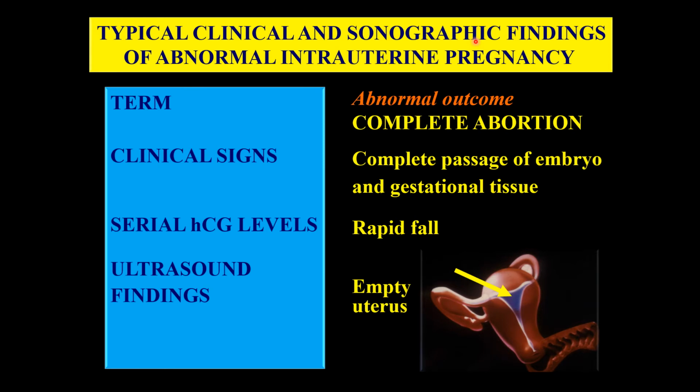Then comes another question: how can intrauterine pregnancy be differentiated from an abnormal intrauterine pregnancy? So how can we differentiate between normal and abnormal? That depends upon the viability.